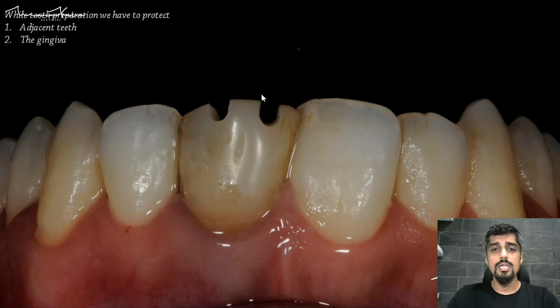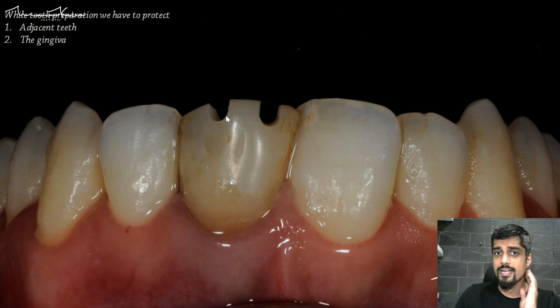You have to remember that you have to protect not only the adjacent teeth when you're doing tooth preparation, but you also have to protect the gingiva. First, I've done some depth cuts into the composite material so that I can provide enough space for my technician to give me this kind of incisal transformation — a translucent halo on this side — representing that amount of space.